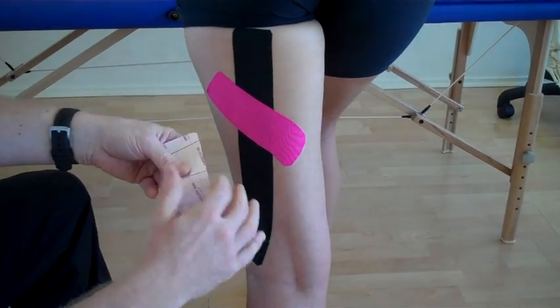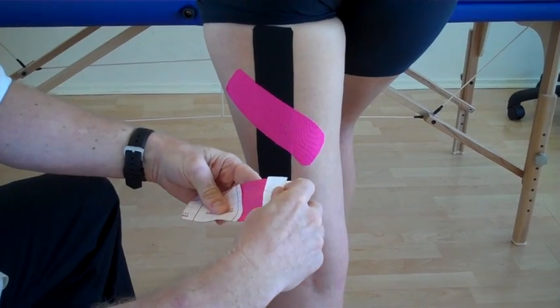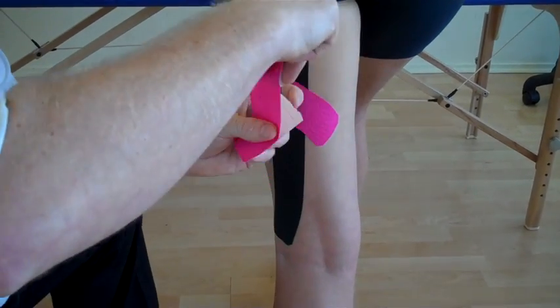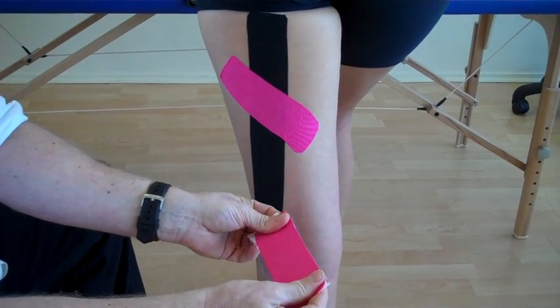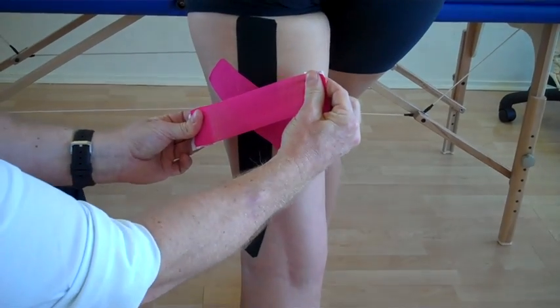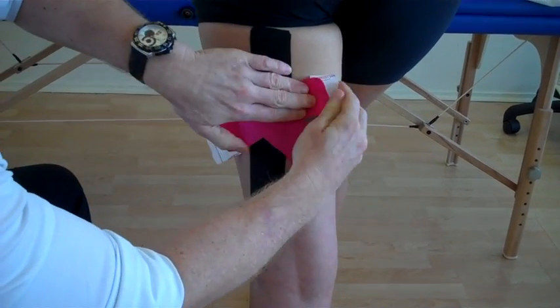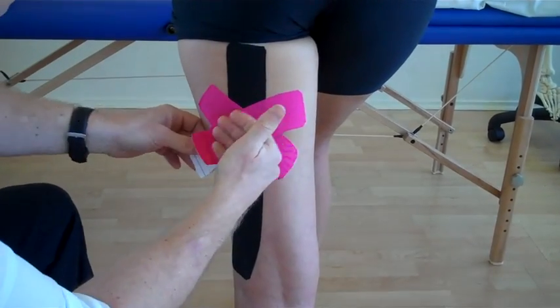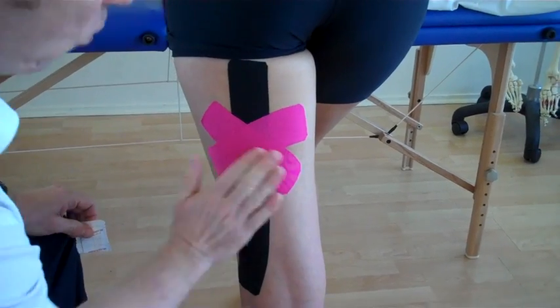And the second piece — split the tape in the centre, same as the first piece. Peel it back on both sides and hold onto it. Try, if you can, to have your thumbs relatively flat so you can get stretch within the actual core of the tape. Come across and lock onto the area. The last phase, feed out with no stretch on both ends. Warm it up.